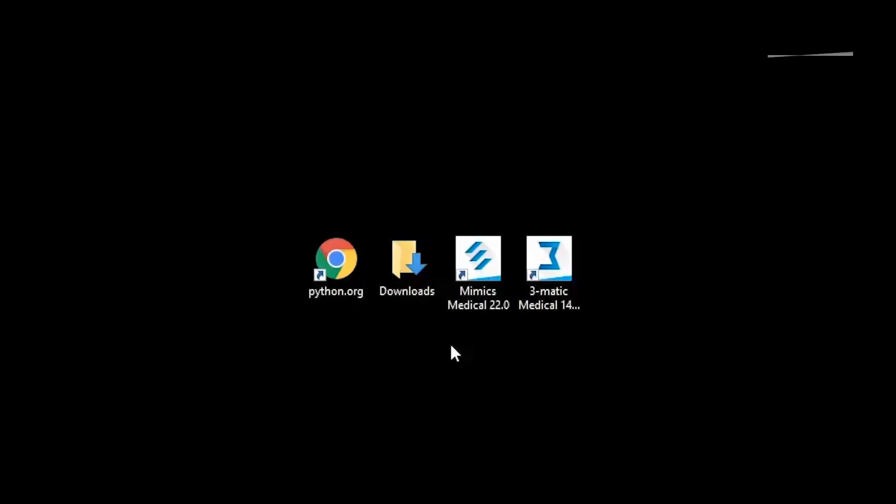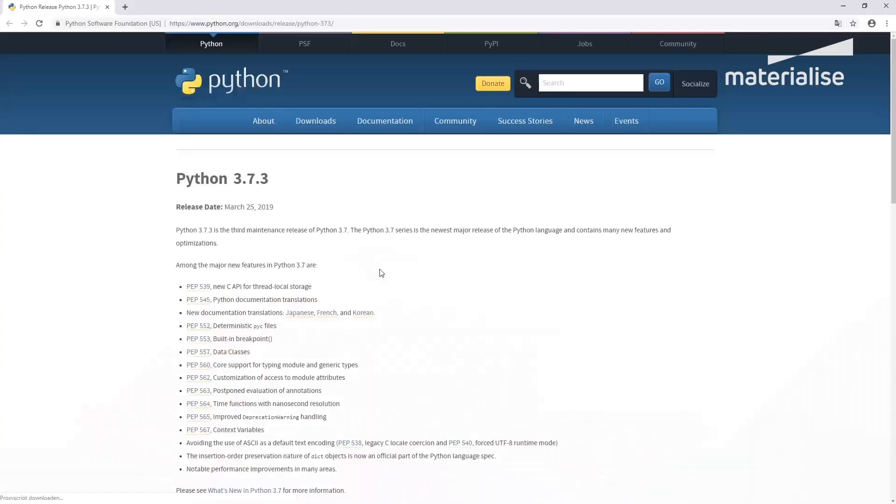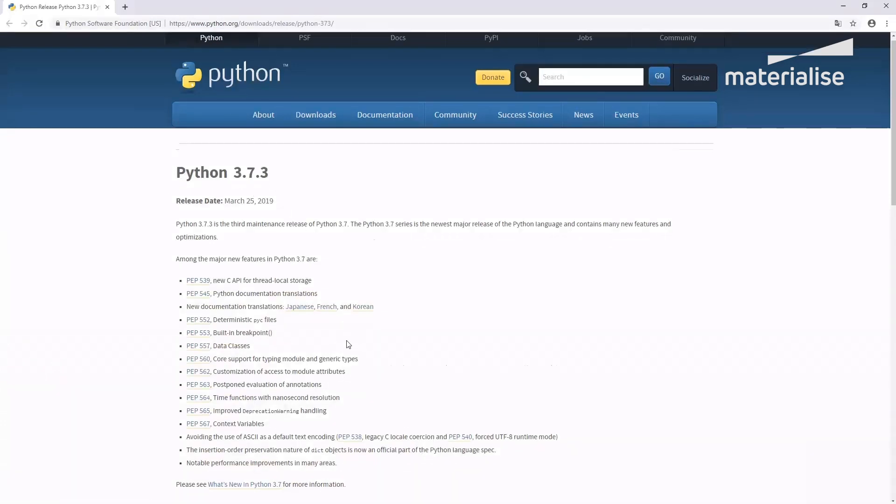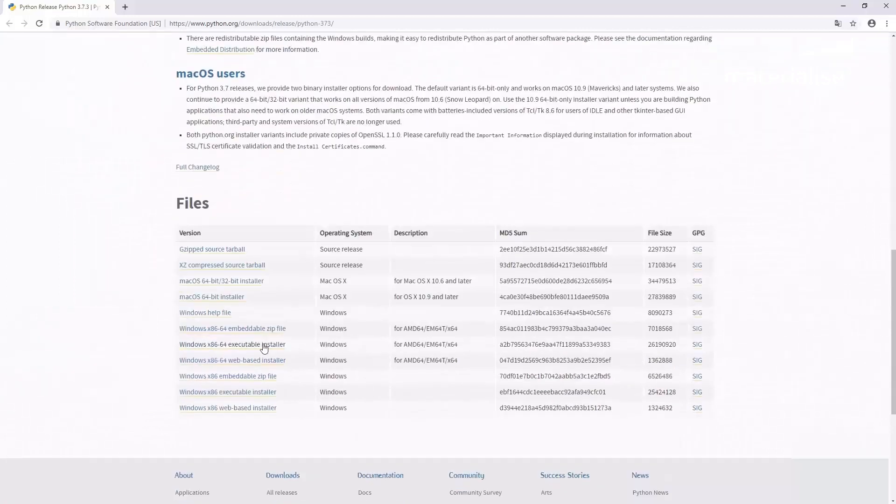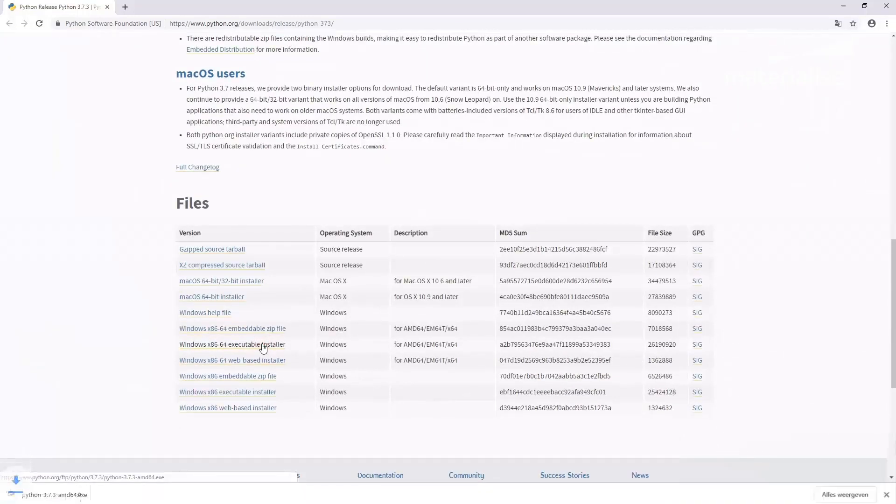The first step is to install Python, which can be downloaded from the python.org website. Please ensure you download the latest 64-bit version of Python 3.7. I'll be downloading the executable installer of Python 3.7.3.